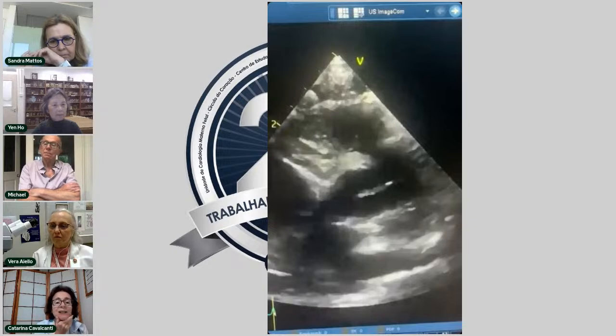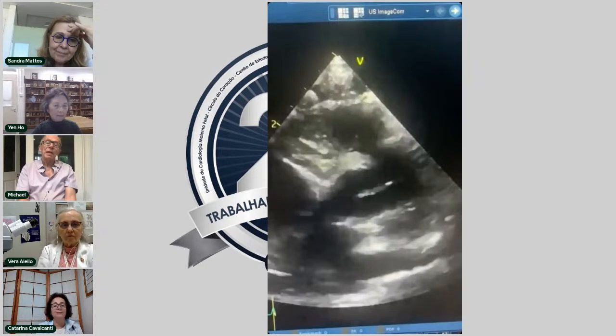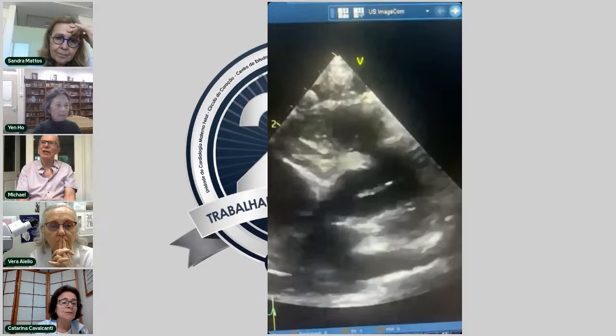I think this is a very important message for echocardiographers: always to look for wrong passages of coronary arteries on the outflow tract. But these images are very good, very, very good. When you say what are the coronaries like, you're not looking to see whether the coronaries are present. It's just to look for this anomaly, really. Obviously, occasionally we see a single right coronary or something, but looking for this anomaly, 5% of all cases of tetralogy of Fallot will have the LAD from the right coronary. You probably have seen it as an incidental finding sometimes, haven't you, Vera?